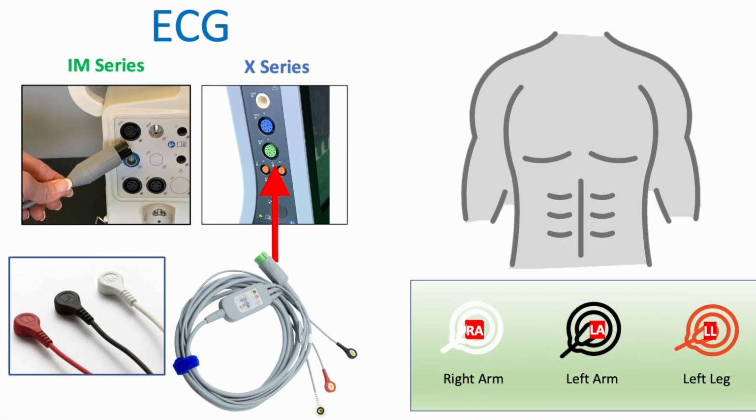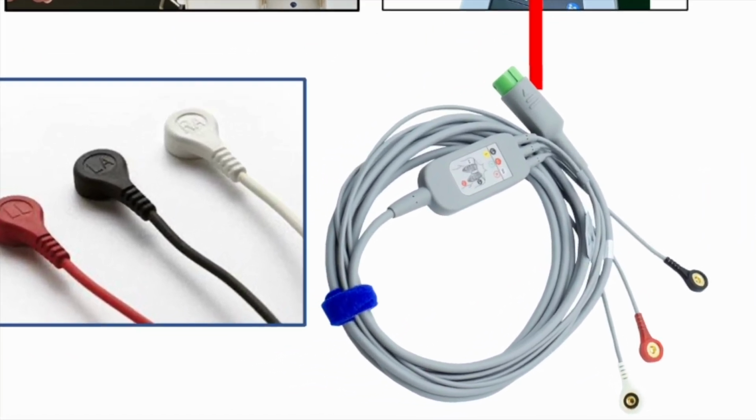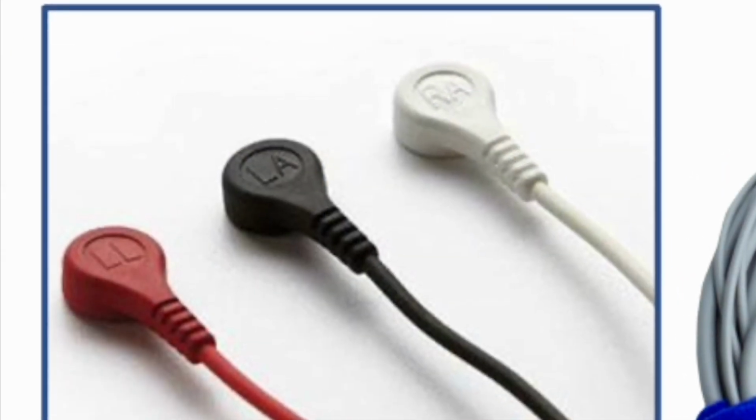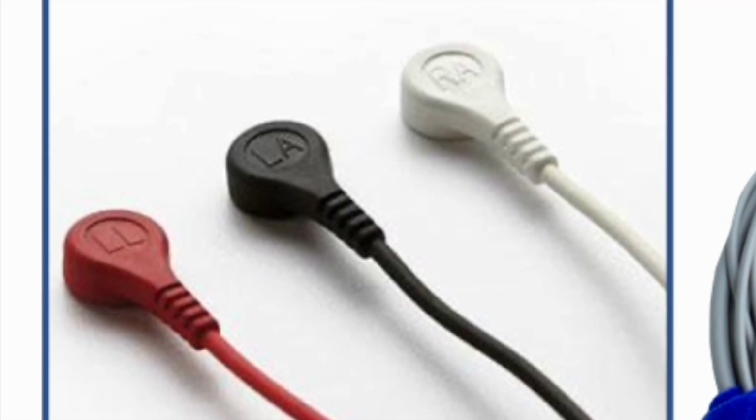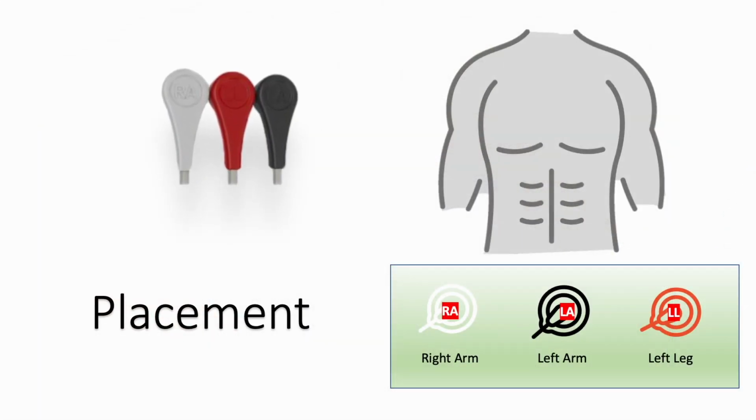Although the monitor is equipped to handle 3-lead or 5-lead cables, generally a 3-lead cable is provided. The lead wires are clearly marked to indicate the area of placement. RA, or the white lead, is placed on the upper right side of the patient. LA, or the black lead, is placed on the upper left side. And finally, LL, or the red lead, is placed on the lower left side.